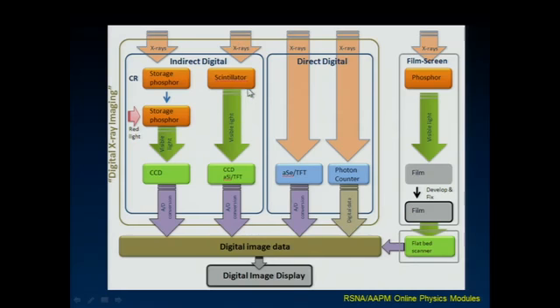There's another indirect that uses a scintillator, right, instead of a phosphor, and some of the flat panel detector systems use this. Remember, these give off light immediately. You don't stimulate them. So they're not useful for doing a portable X-ray and coming back down to read that, right? The image has to be read off as it's being exposed, if you will. And that's still done.